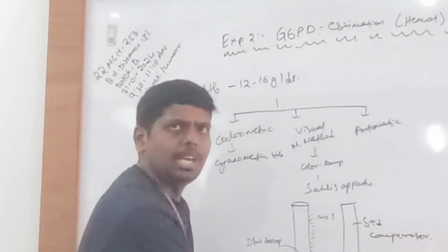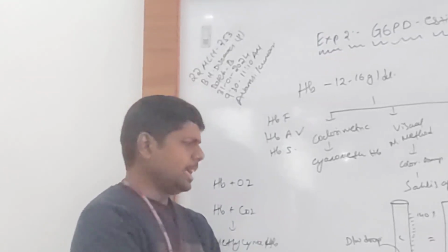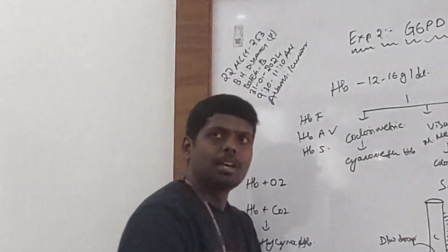There is a comparator, okay? This color should match with this color. Until this color matches with this color, you need to add the distilled water. Drop by drop, you need to add distilled water and you need to check.